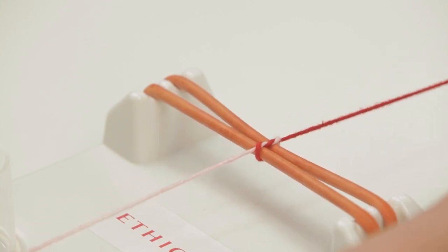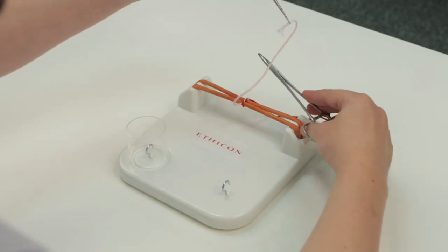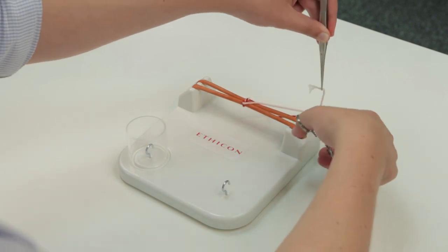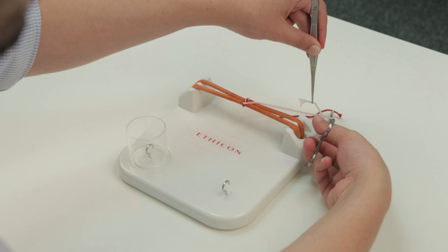You can drop your suture following this and then roll the other end around the needle holder again in the opposite direction. Grab the suture with the needle holder and pull towards you.